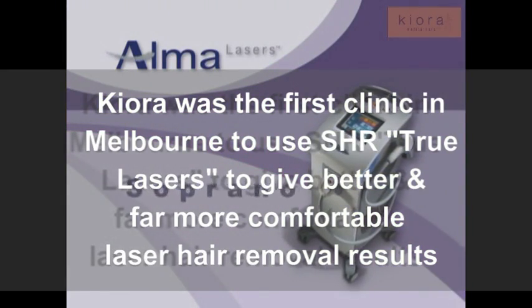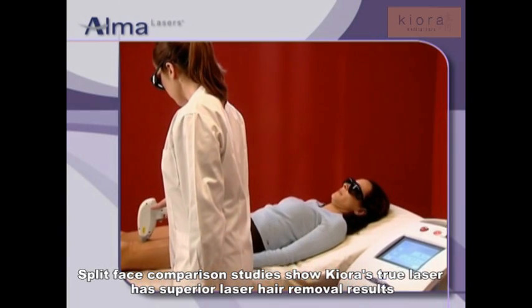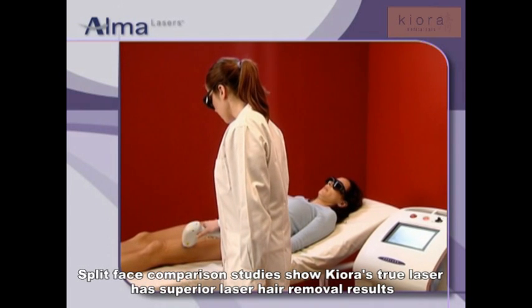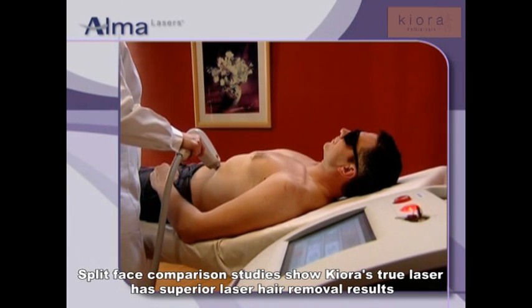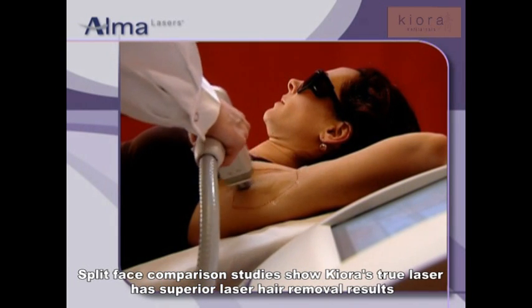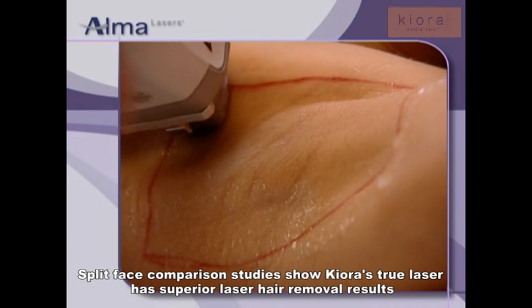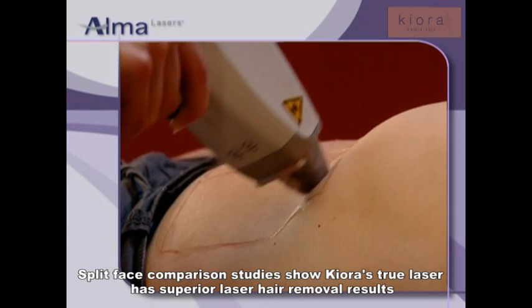Alma Lasers is proud to introduce the Soprano XL Diode Laser System for Hair Removal. The Soprano XL Dual Mode System launches a new era in hair removal. The Super Hair Removal Mode, SHR, is a revolutionary new approach for improved effectiveness and comfortable hair removal, dramatically changing the way laser hair removal has been performed for the past 15 years.